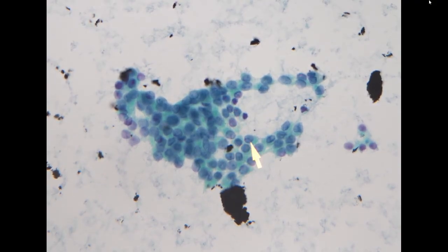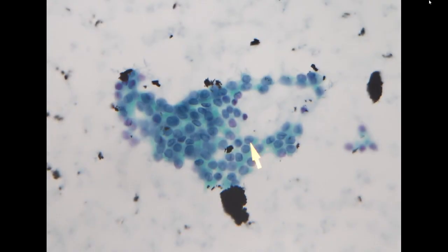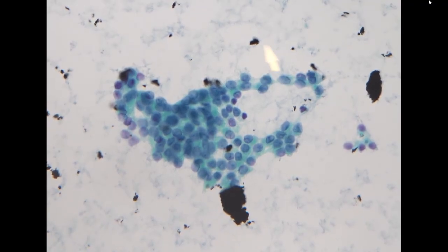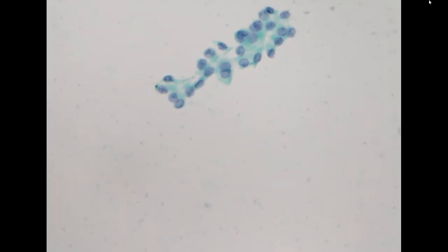Here we see a ground glass chromatin pattern, and most of the cells have a little bit of irregularity of the nuclear membrane. Some show definite nuclear grooving and overlapping. So this arrangement is very typical for papillary thyroid carcinoma. This is the first cluster. This is the second cluster.